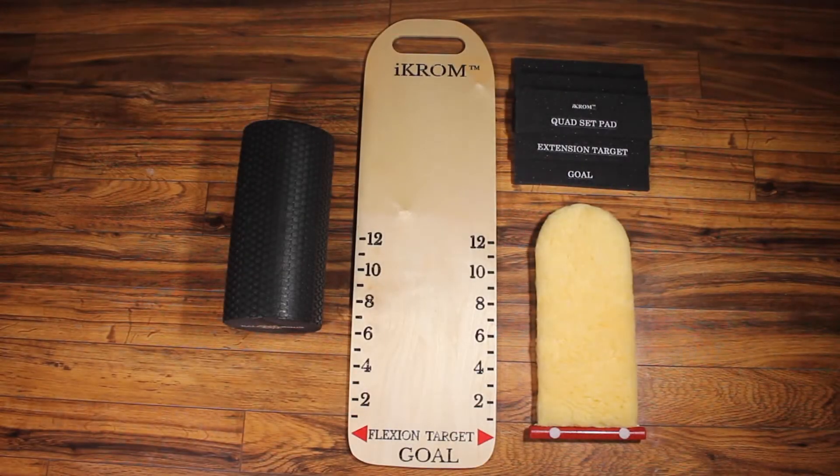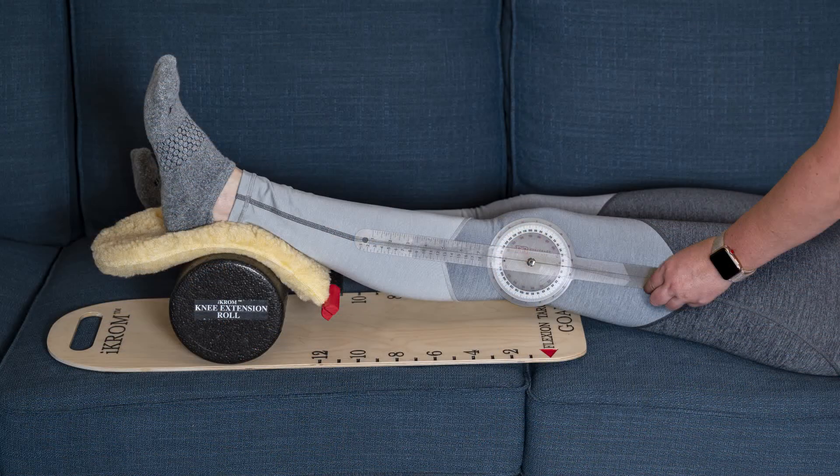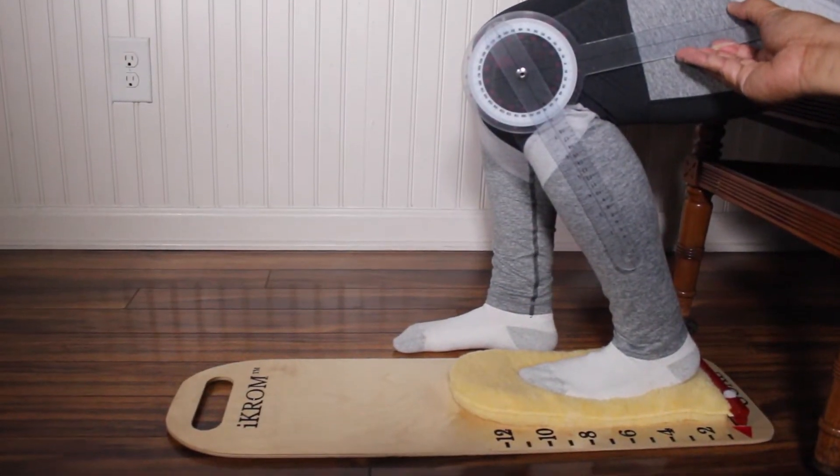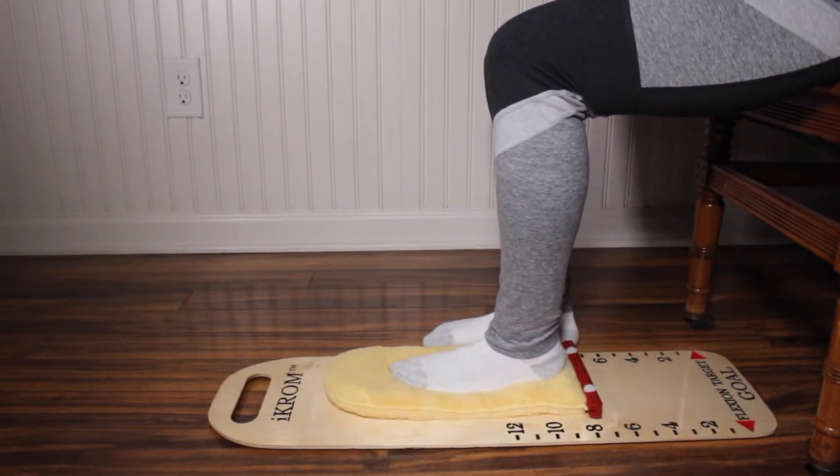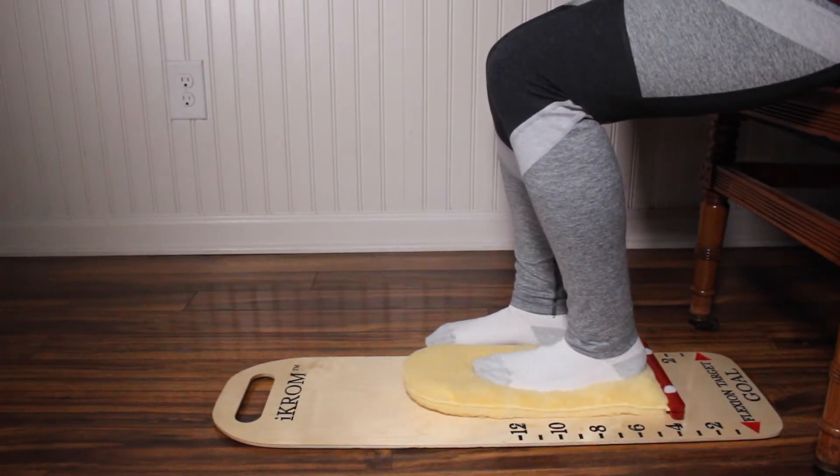The ICROM exercise kit facilitates performance of key conventional exercises needed to achieve zero degrees of knee extension and 110 or more degrees of flexion. We recommend that you use this tool regularly while in the hospital after surgery and at home to improve outcomes.